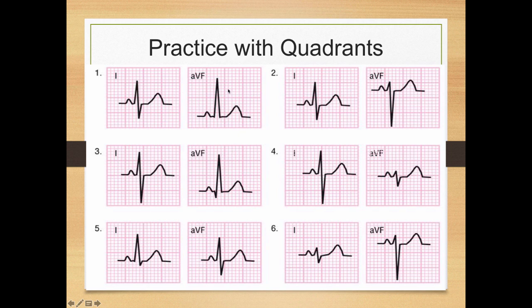I think we can agree that this is positive. So AVF is completely positive, but lead one's got some positivity, it's got some negativity. So we've got to stamp something onto that. Is it a little bit more positive, a little bit more negative?